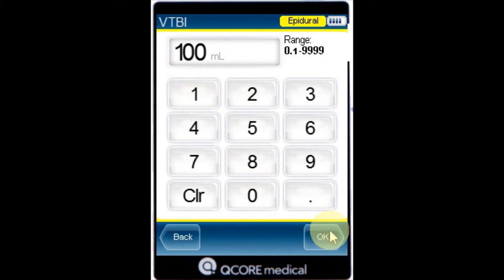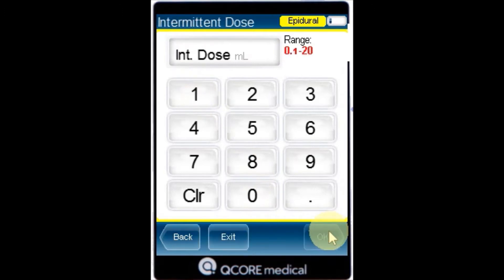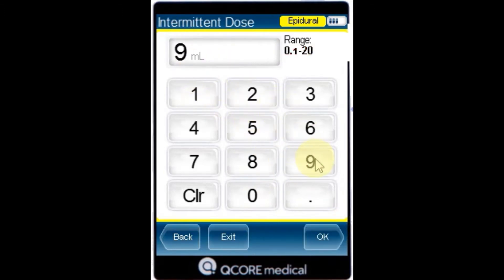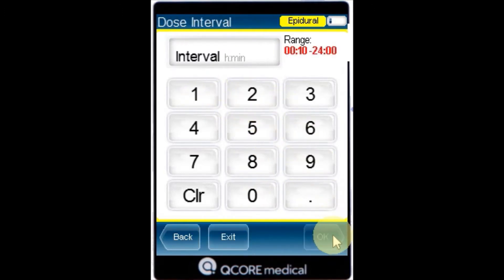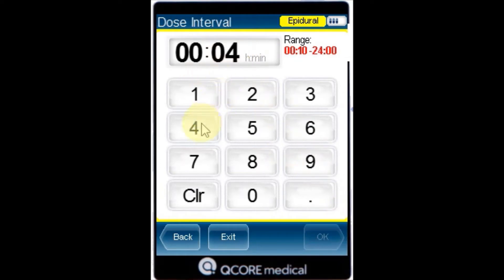Using the keypad, enter the intermittent dose, then press OK. Using the keypad, enter the dose interval, then press OK.